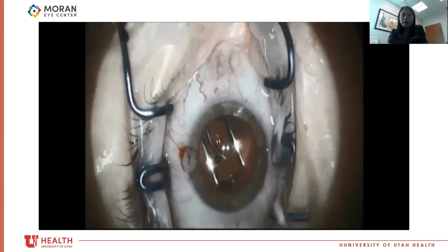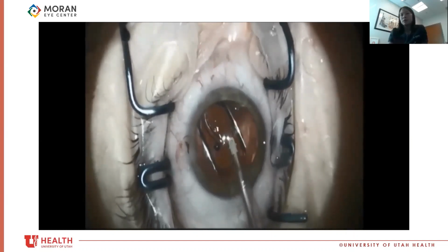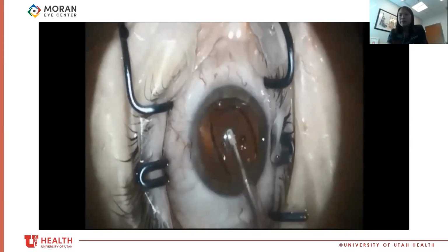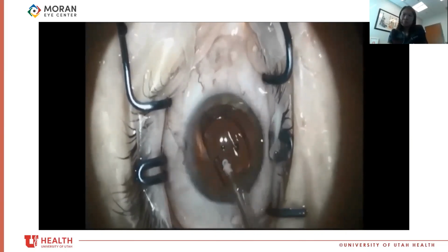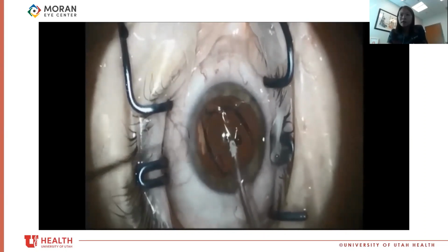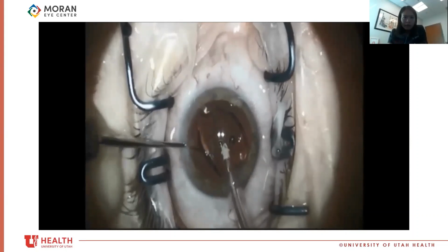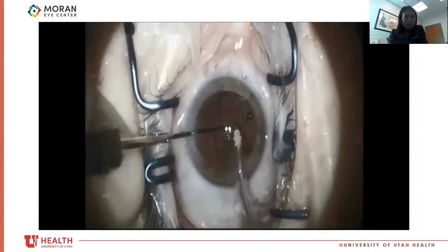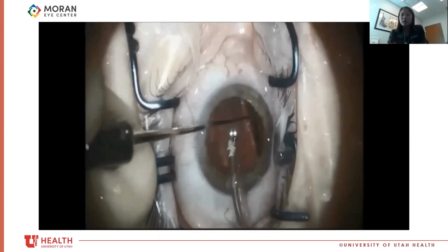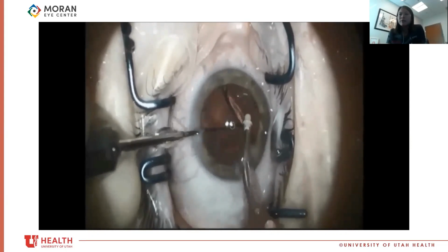Get the IA. Gonna take out the viscoelastic. And it's unfolding pretty nicely. But it decides to flip on me, which had never happened to me before. I thought I'd waited long enough for it to unfold. So, I thought, well, it flipped so easily going in, maybe I can get it to unflip. But, of course, by this time, the optic has actually been folded fully. So it's really tough for me to flip it.